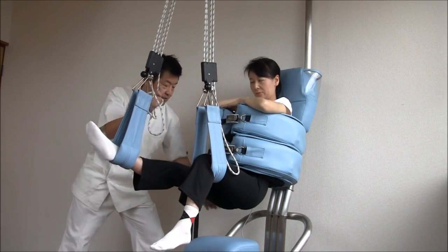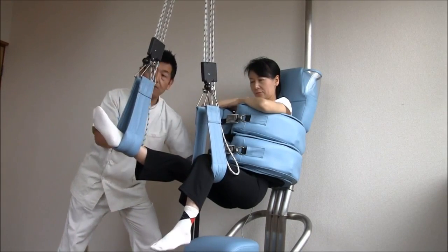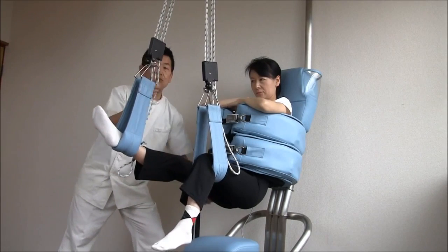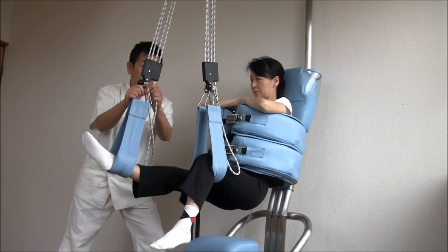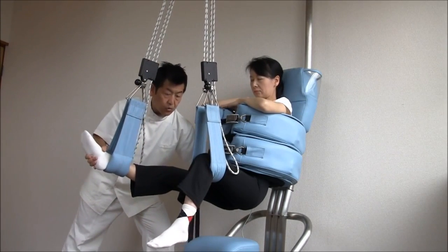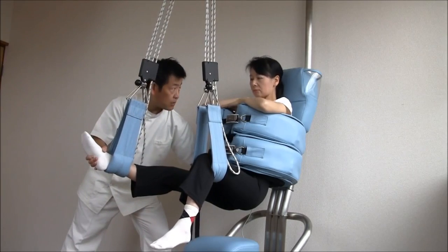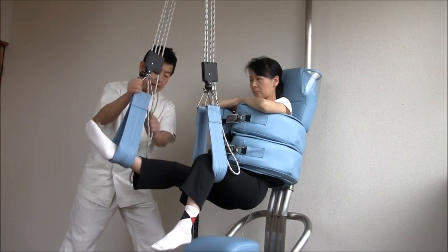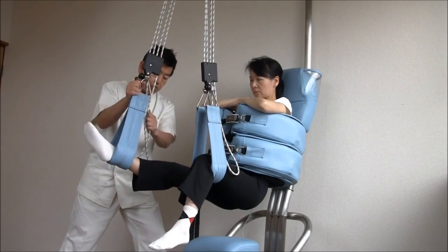Find out what angle the pain is reproduced in the patient while pushing anterior to posterior and left to right. Try to stay parallel to the long axis of the femur bone. Find the angle that has the most tension and apply the same pressure. If the patient is experiencing a lot of pain, stop. Continue the treatment otherwise.